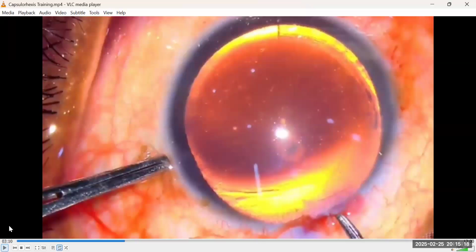Dispersive visco is readily available in our environment, but some advocate the double shell technique, whereby one has used dispersive visco and you now use cohesive visco, direct it at the capsule, it will push and disperse further the dispersive visco. In that way, the endothelium is highly coated.